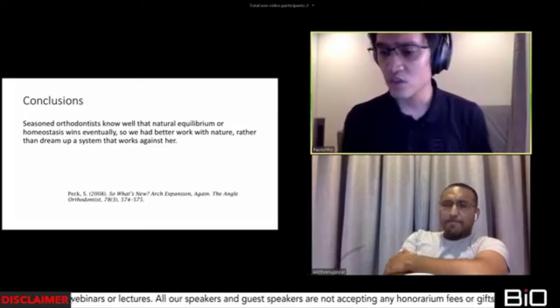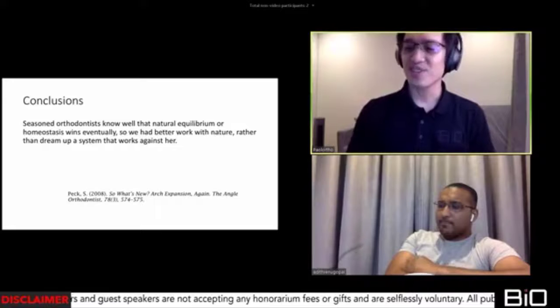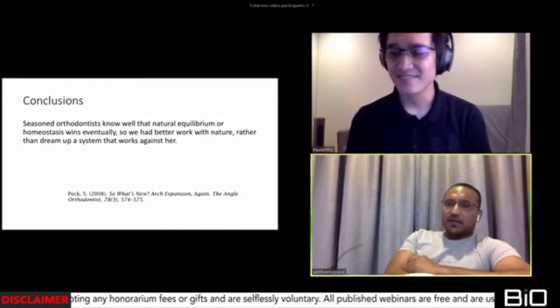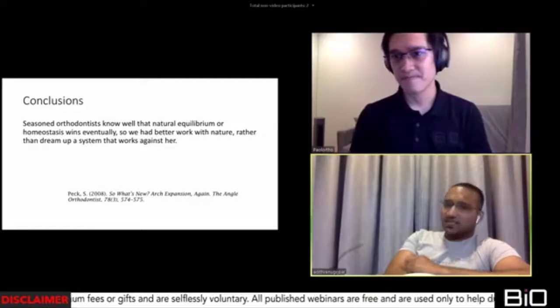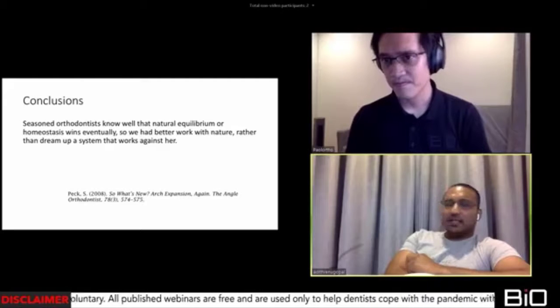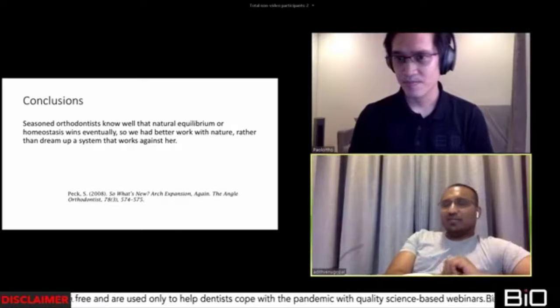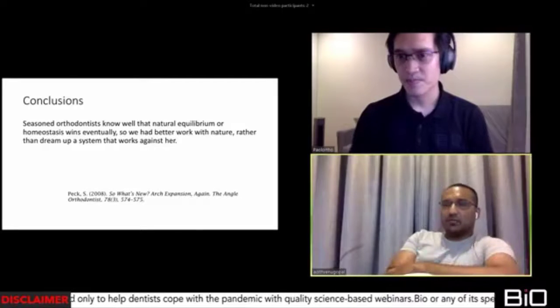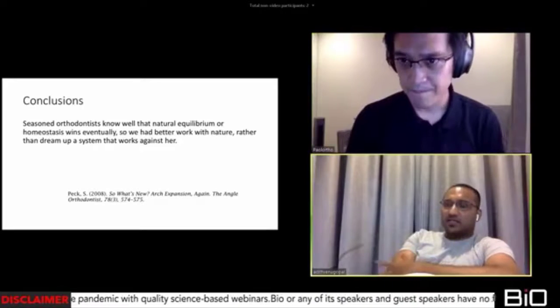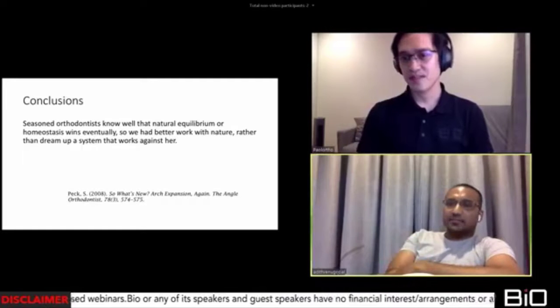Next, from Dr. Corina Netku, where do you insert the buccal shelf to distalize unilateral after you extract the third molar? I place them in the buccal shelf. That is somewhere right alongside the first and second molar. You can palpate it with your thumb, and you can feel it, and then you can just insert the buccal shelf screw, which is of about 1.8 into 10 millimeters dimension that I use. And then you can use it unilaterally. The wire is 19x25. You can use a single hook, and you can just distalize on one side.